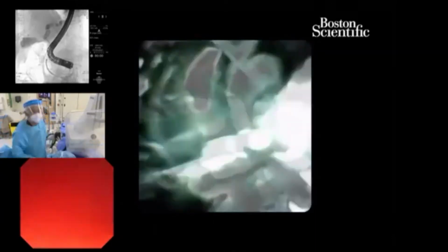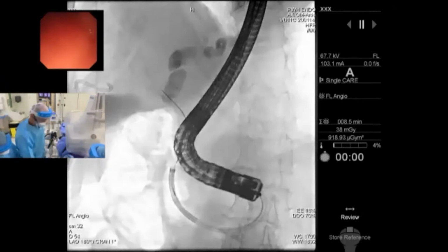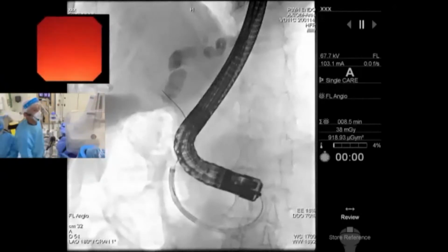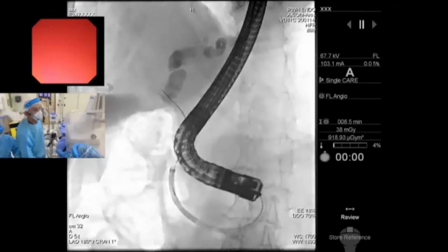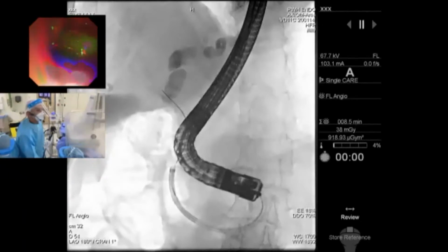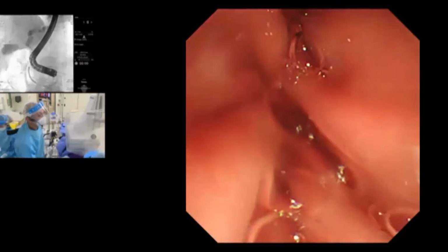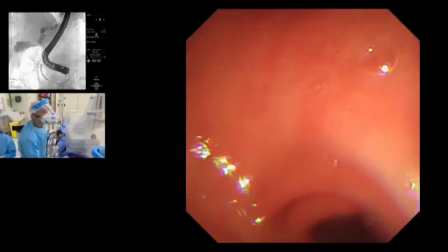All right, let's change the question of the spyglass: is it better to be operated by two operators or a single operator? What do you think, Anthony? Especially with these difficult cases. Yeah, for me, I always do it on my own because I don't always have someone helping me. Of course, you can have two persons doing it, like the way we used to do mother and baby cholangioscopy. I think both options are okay.